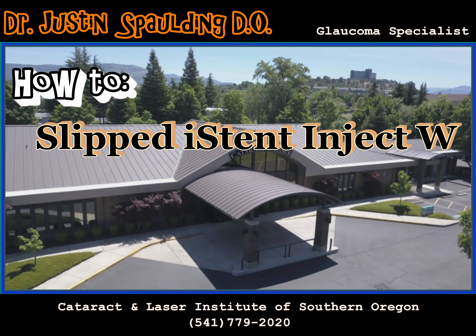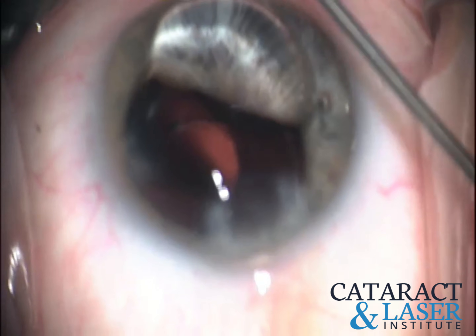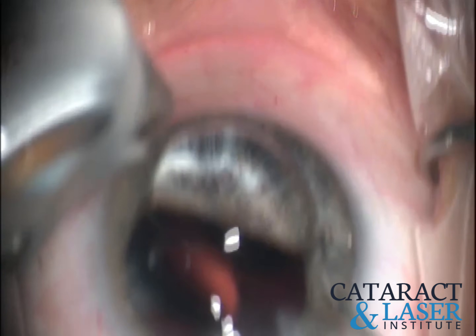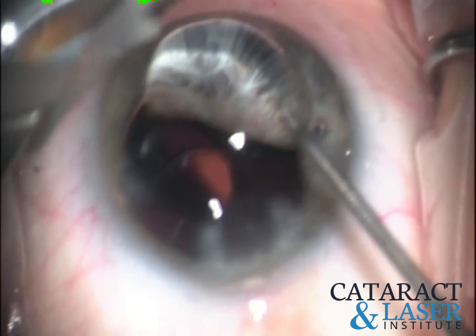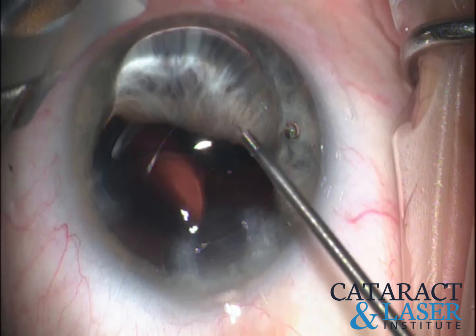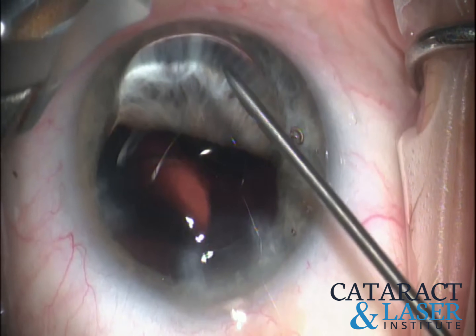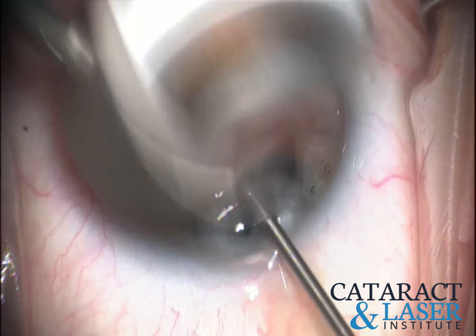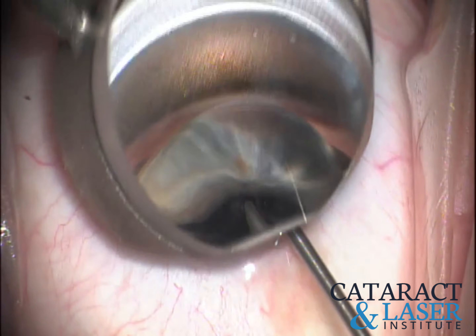This is an interesting example of when the iStent inject Wide doesn't go into place exactly where you want it to. The first thing we do is test the iStent injector — move the slider up and down a couple times just to make sure it's nice and smooth operating before going in the eye. I like to fill up the eye with a generous amount of viscoelastic to deepen the anterior chamber.